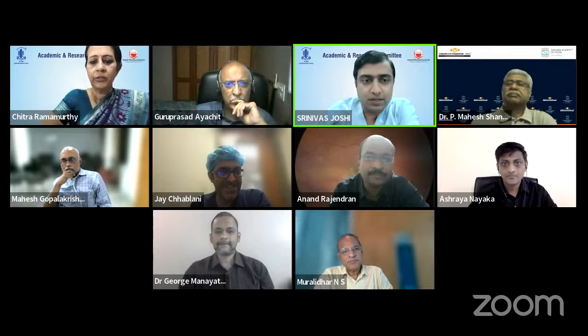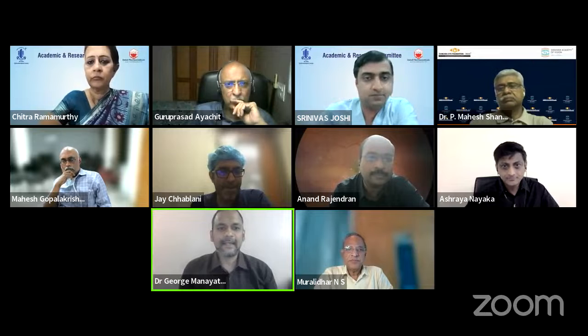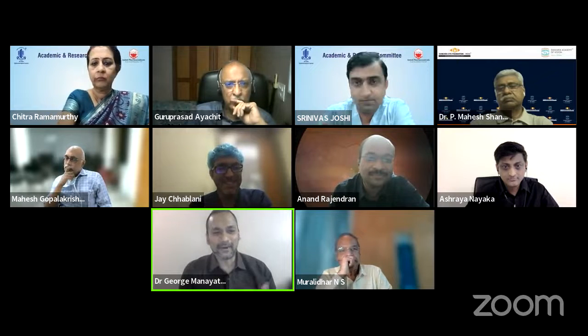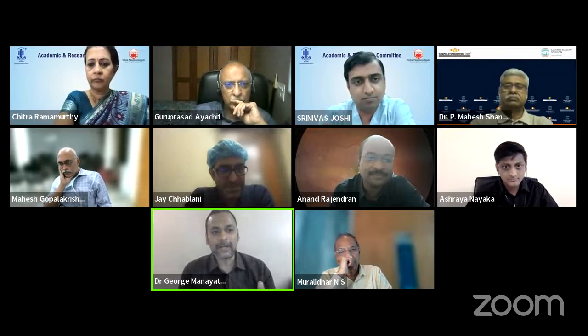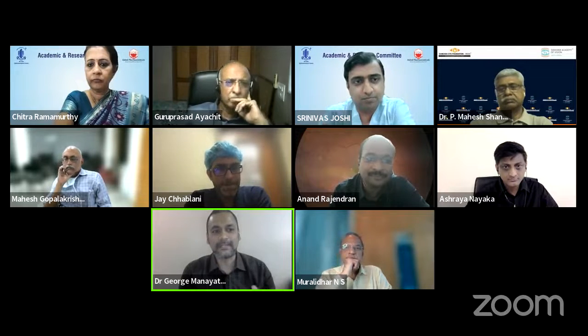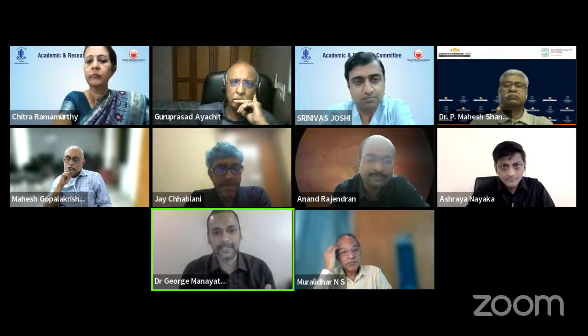Yeah, I think George sir wanted to make a point. Yeah, quickly. Thanks, Jay, once again, for bringing this up on OCT angio. Now, even in chronic CSR, the pathophysiology has moved into inner choroidal capillary ischemia, especially as shown on OCT angio, overlying these huge pachy vessels which are compressive in nature. That's the first point that Jay mentioned, about the inner choroidal ischemia, that is, low flow areas.